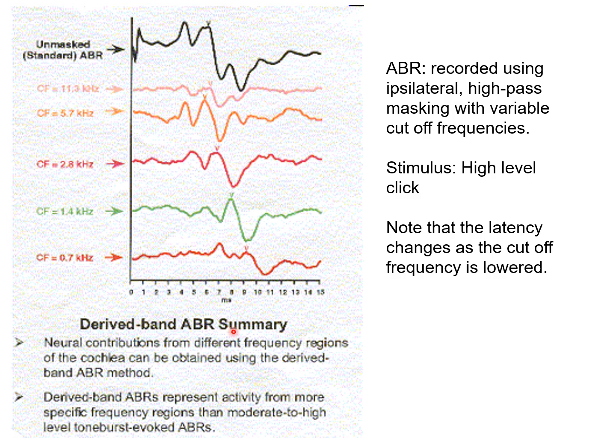So this shows a real example of stacked ABR, and the figures shown here are raw recordings. We haven't added them together yet, so these ABR waveforms are the raw material. On the next slide, we will move the waveforms to align wave five and add them together.